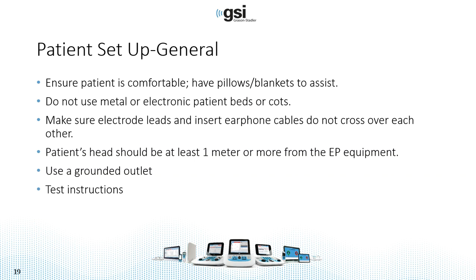And you want the patient's head to be positioned at least a meter away from the evoked potential equipment. We're going to plug the Audera Pro directly into the wall using a grounded outlet. We don't want to use any power strips because they can introduce noise into the system. And then, of course, in the case of an adult, you want to give test instructions so they know how long the test will last, or give the instructions to the parent.